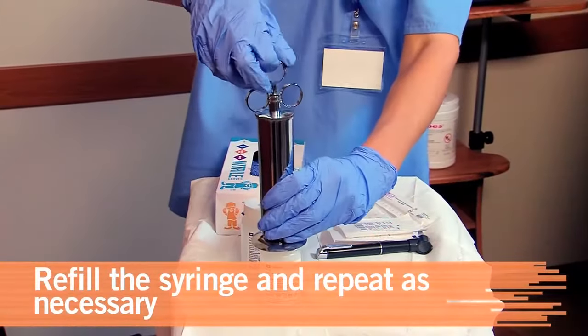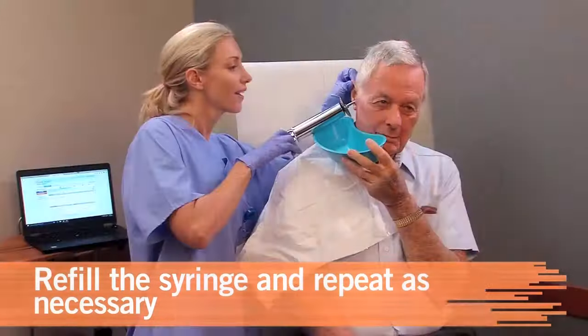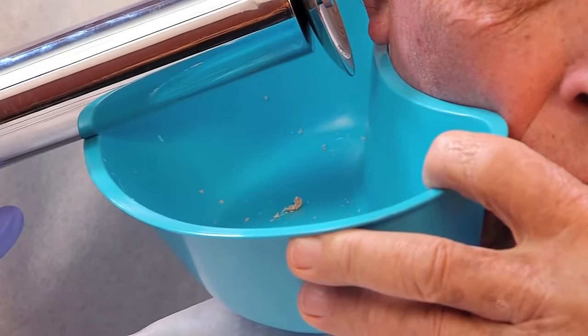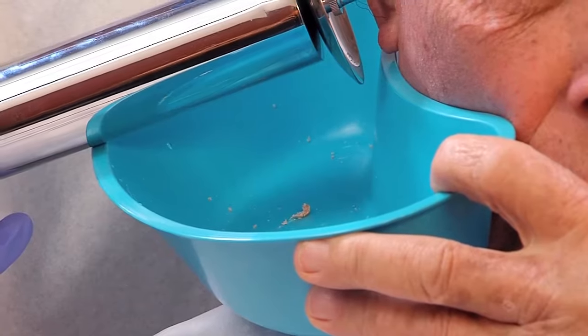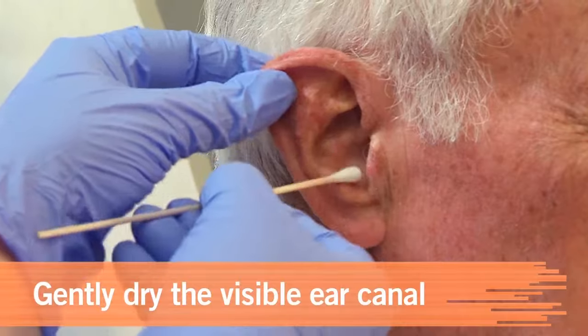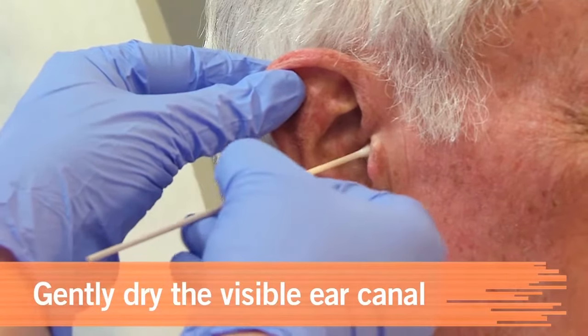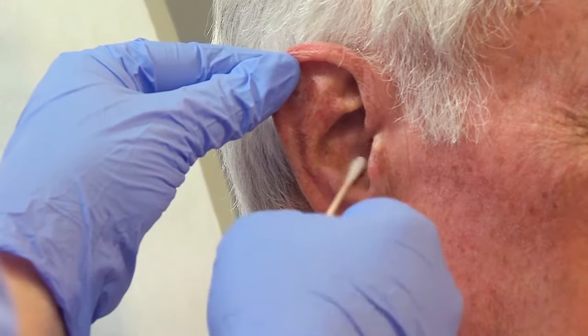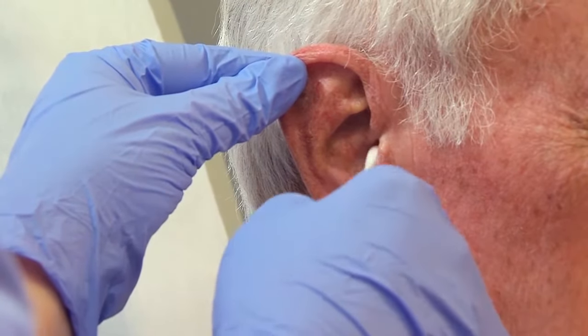Refill the syringe with warm solution and continue until the material has been removed. Note the particles in the collecting basin to be evaluated after the procedure. Dry the patient's outer ear, then dry only the visible portion of the ear canal with a cotton-tipped applicator. Don't insert it any farther, as doing so could cause serious trauma.